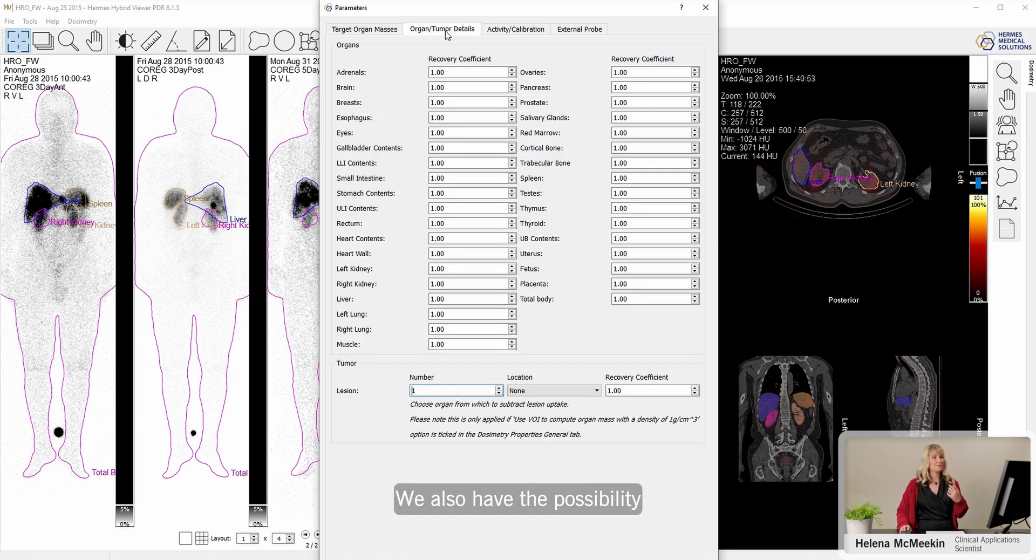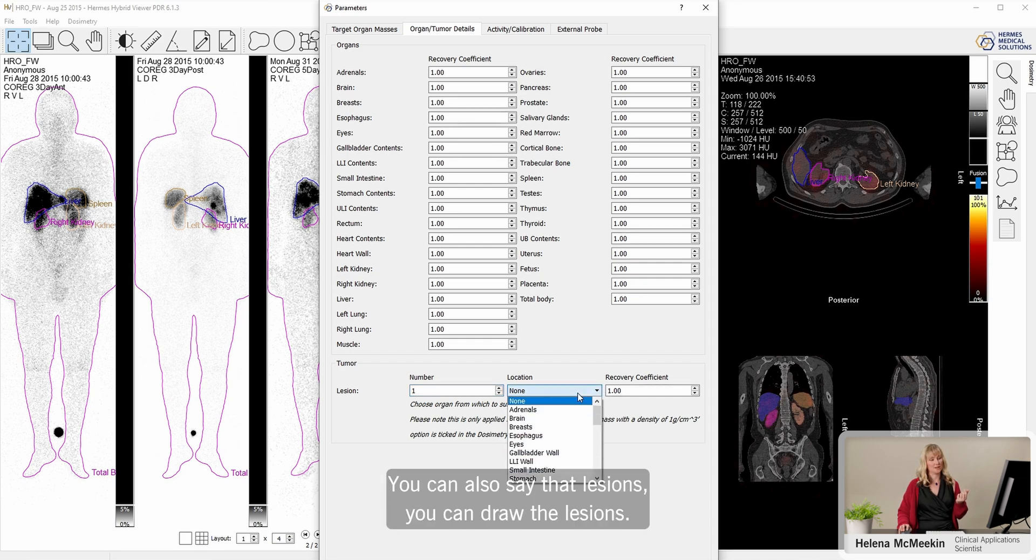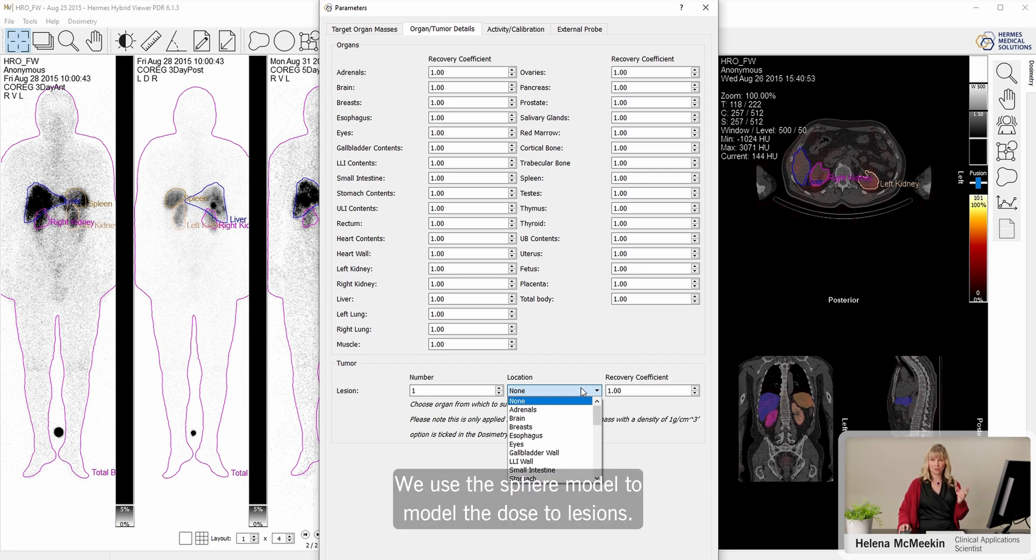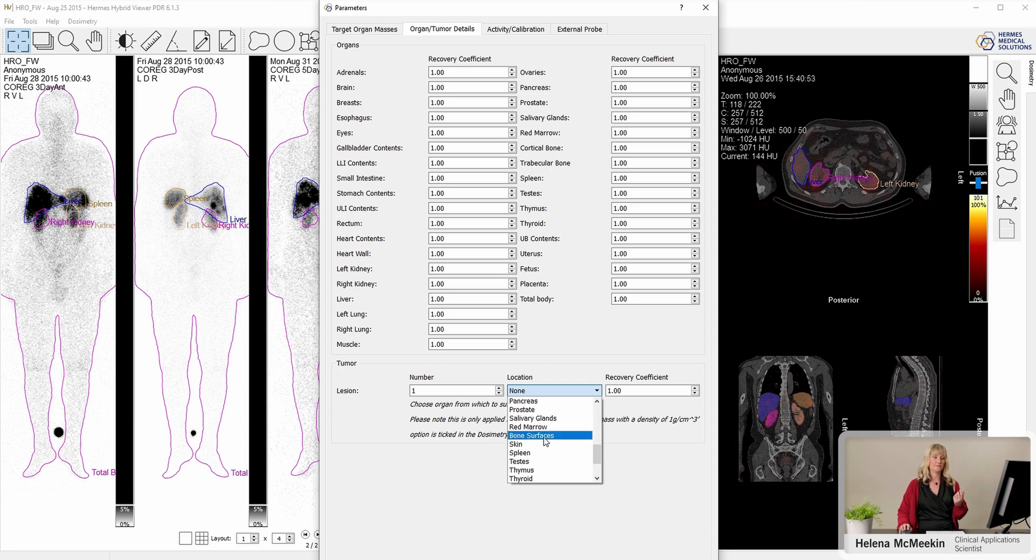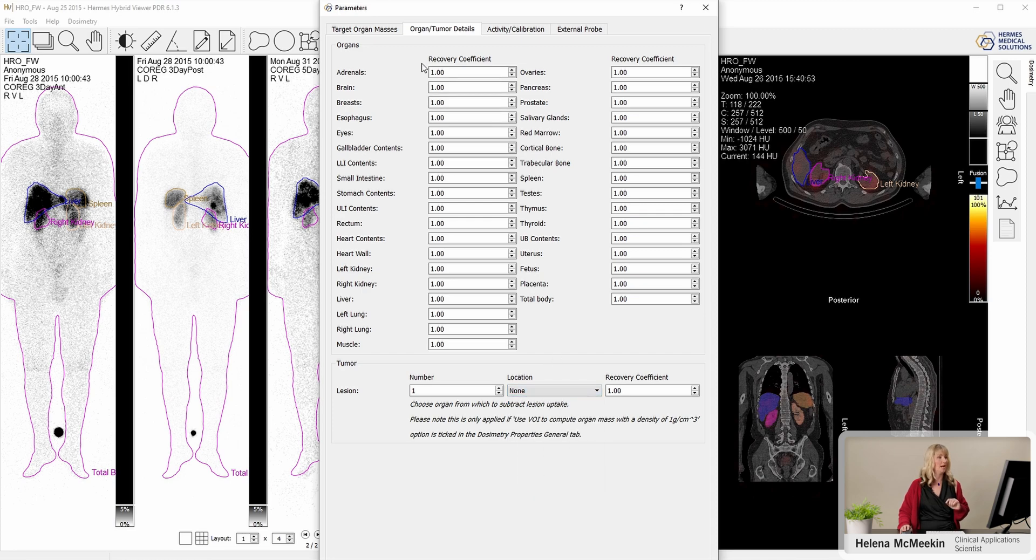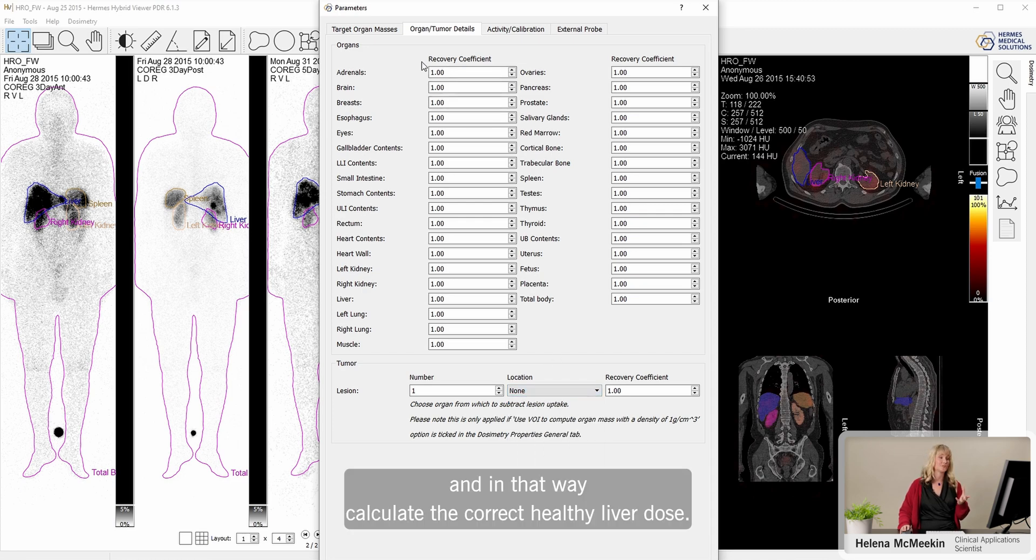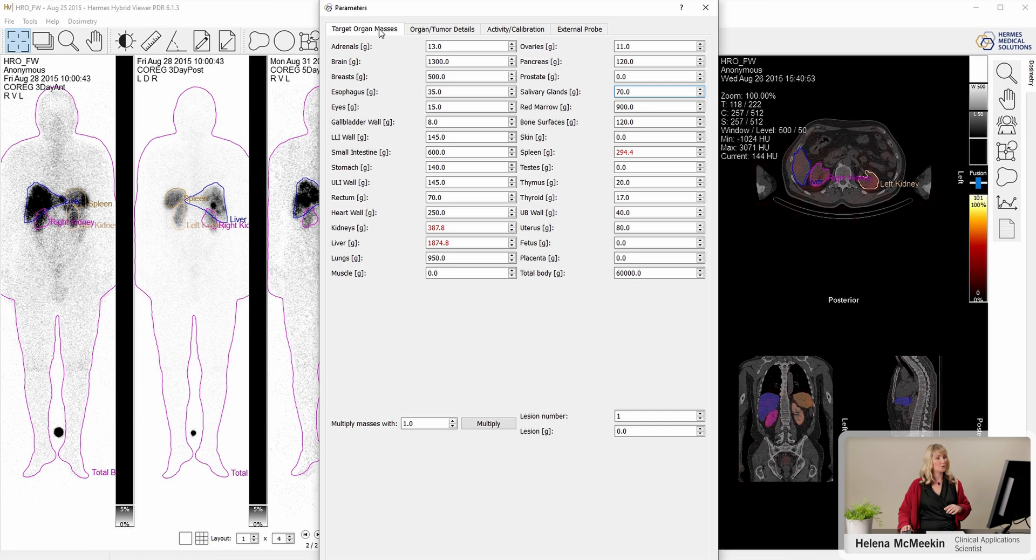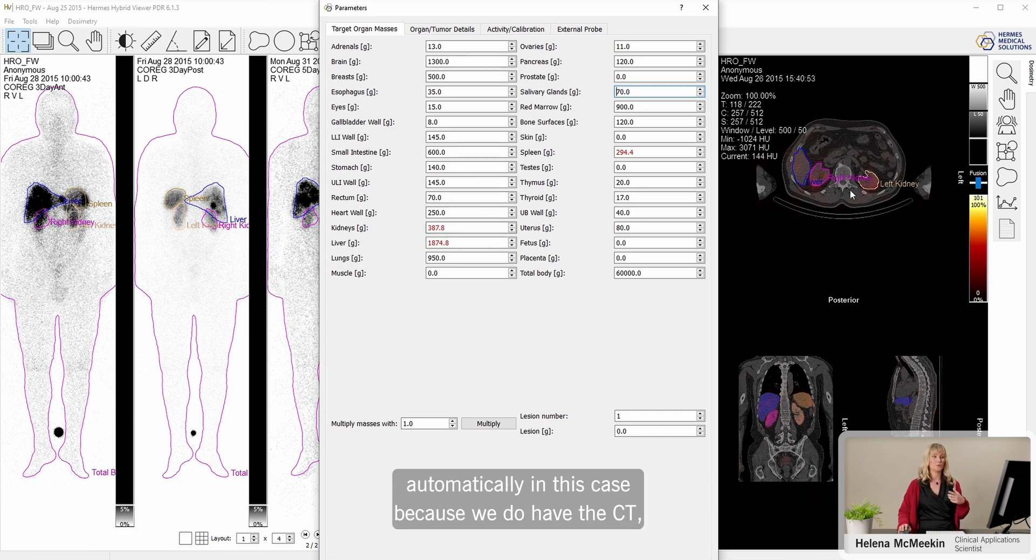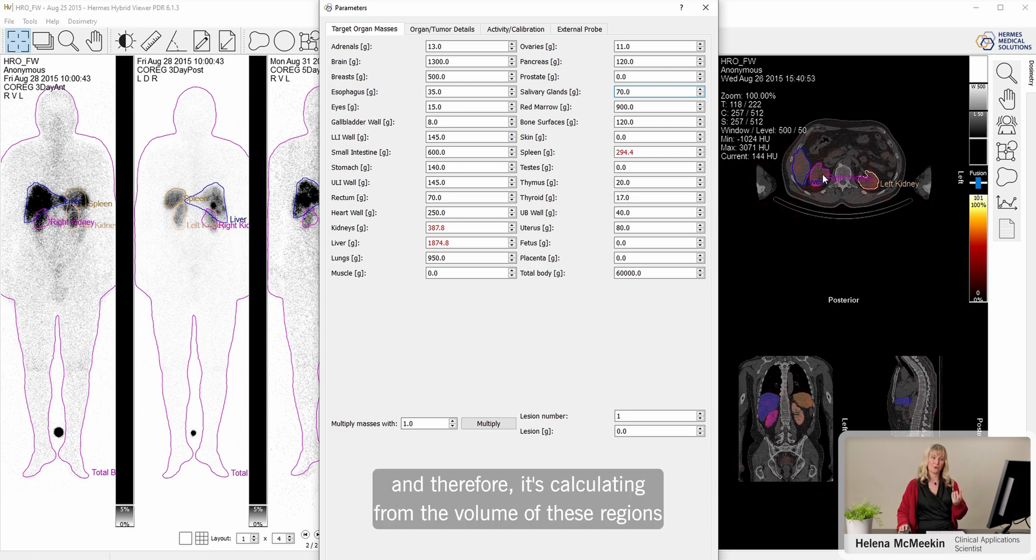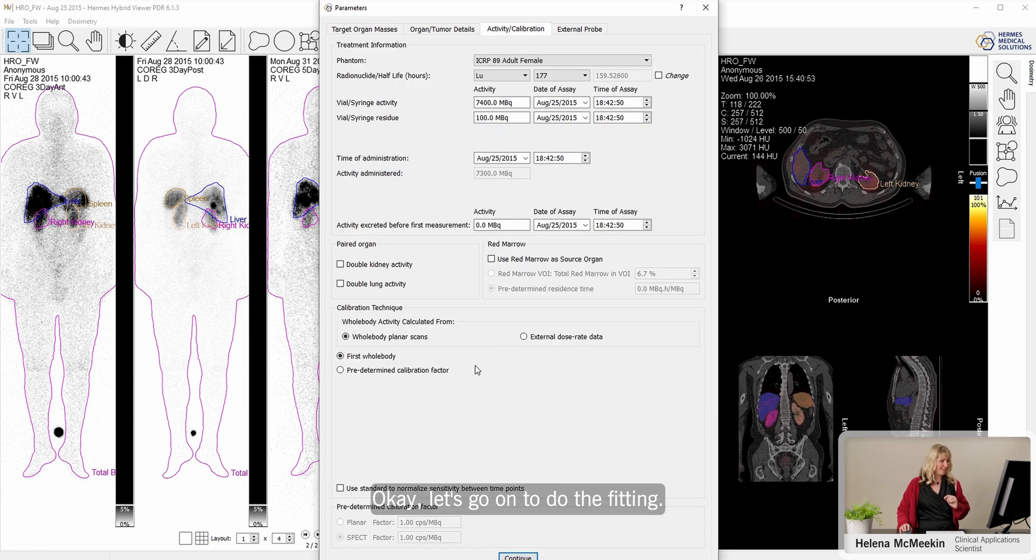We also have the possibility to set some recovery coefficients for different organs if you know them. You can also draw lesions. We use the SPHERE model to model the dose to lesions, and then you can take that out of a particular organ if there's a tumor in the liver, for example. You could remove that and in that way calculate the correct healthy liver dose. It's also possible to scale the organ masses. In fact, the application is doing that automatically in this case because we do have the CTs. We have regions that we know correspond to those organs, and therefore it's calculating from the volume of these regions what their mass will be and just overwriting the information already there with this.